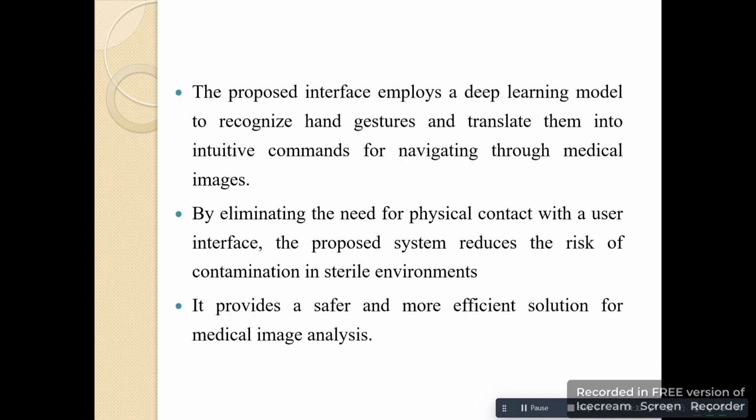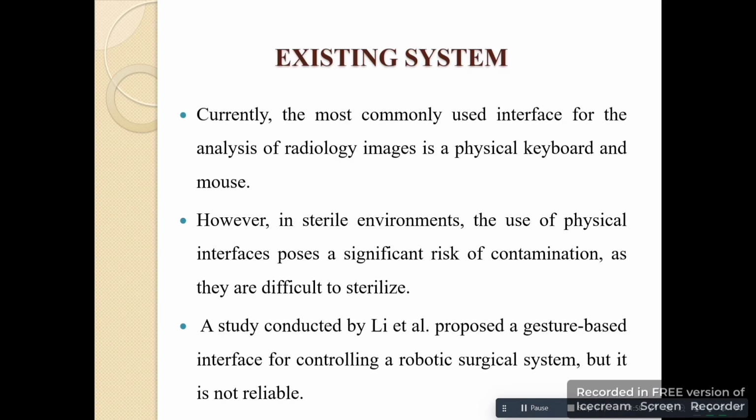The proposed interface employs a deep learning model to recognize hand gestures and translate them into intuitive commands for navigating through medical images. By eliminating the need for physical contact with the user interface, the proposed system reduces the risk of contamination in sterile environments. It provides a safer and more efficient solution for medical image analysis.